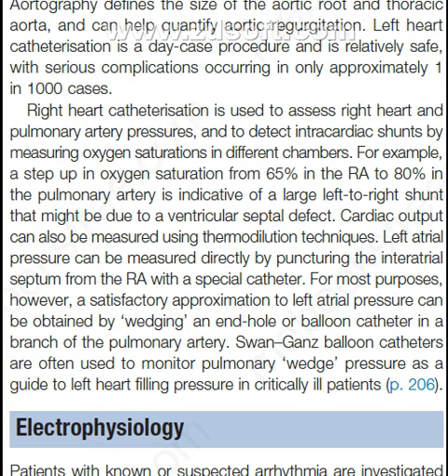Swan-Ganz balloon catheters are often used to monitor pulmonary wedge pressure as a guide to left heart filling pressure in critically ill patients.